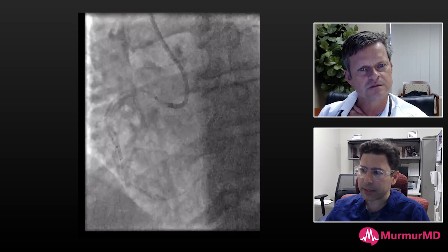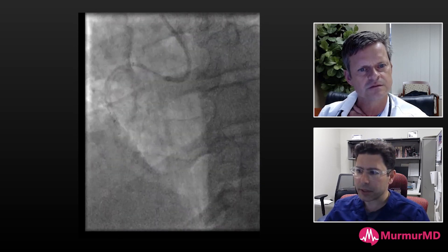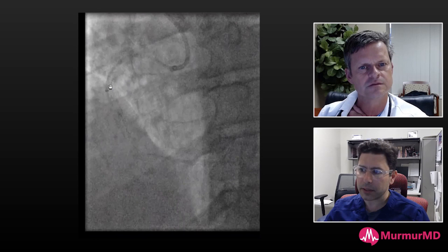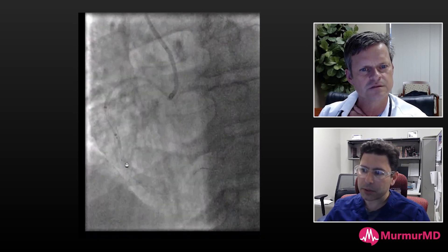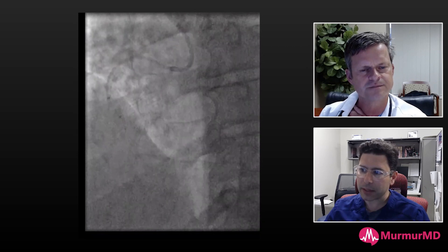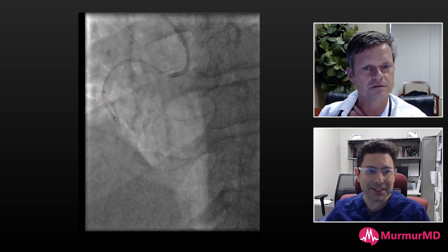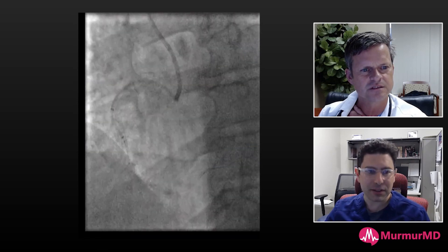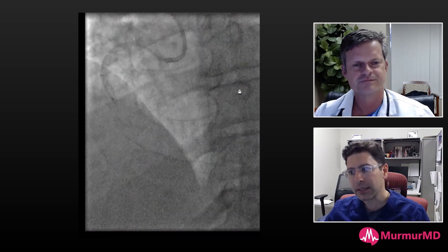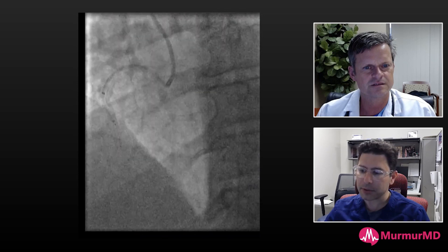At this point the guide extension is sitting proximal to the most difficult lesion. This is a 40×12 shockwave balloon, and you can see the 8 French guideliner was advanced as far as it can go — this is what allowed me to push the shockwave balloon through. You can see the guide is struggling and almost flying out. We have an 8 French by 45 Destination sheath, a large guide, an 8 French guide extension, a 6 French guide extension, and even with all of that and with pre-dilation, the shockwave is having a hard time passing through.